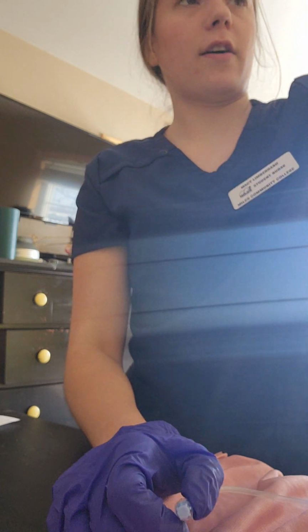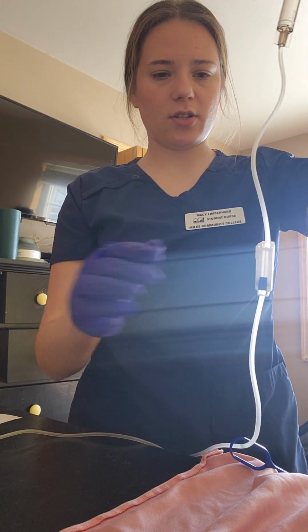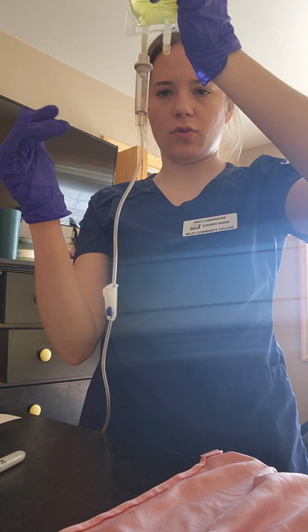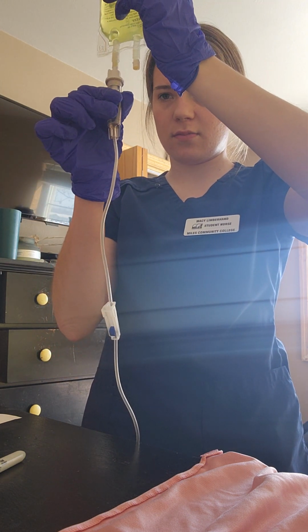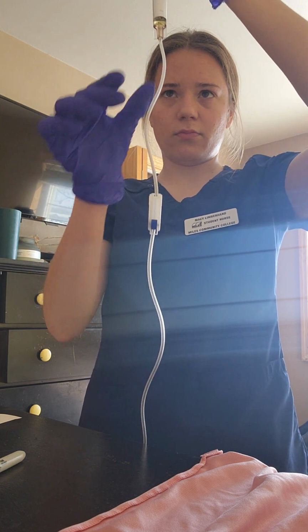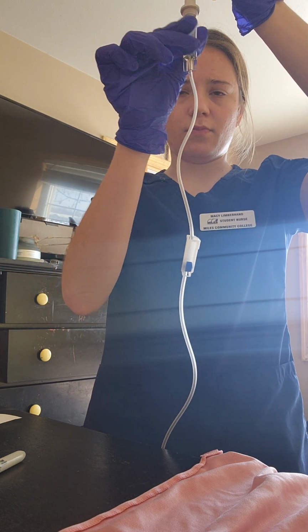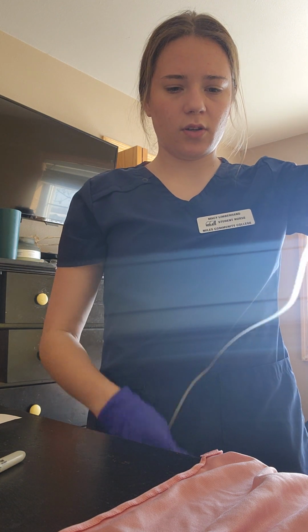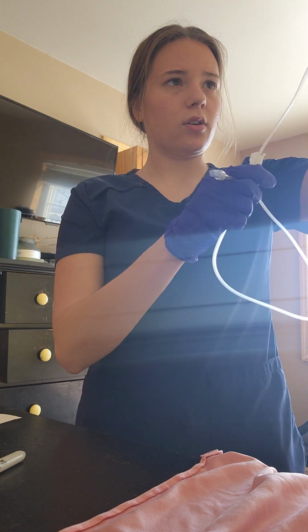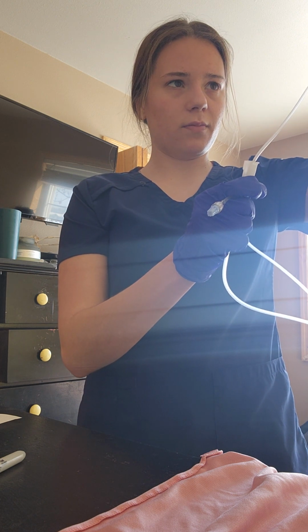So then after I hang it, the clamp is set, I'm going to squeeze this drip chamber. There we go. Okay, and then I'm going to get it going.